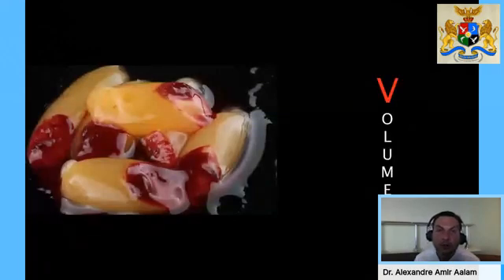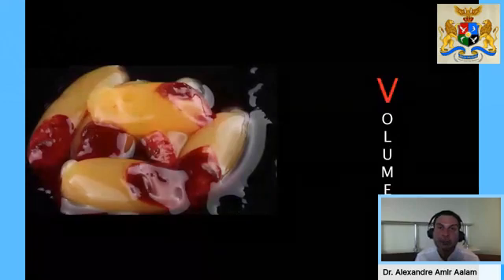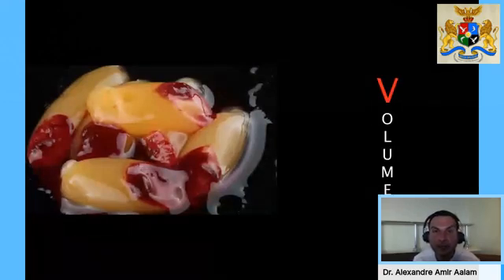Again, remember, the PRF concept is an autogenous blood derivative, meaning that if you want to see clinical results, you need to increase the volume of these membranes because we're dealing with picograms of release of autogenous level of growth factors. Not only the release is slow, but there is a lot of variations that happen between patients, age and sex, and we still today do not have a formula for that. So as an empirical rule, you have to upcharge the site and place as many membranes as possible in the hope of getting the most release of those growth factors into the surgical site and get the best clinical translation.